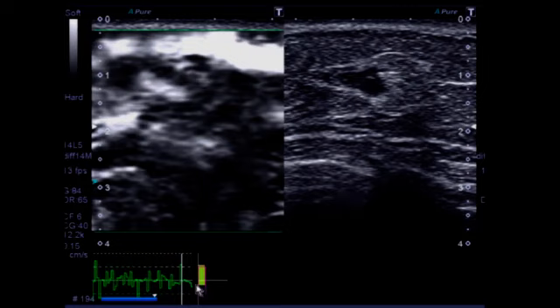And again, here's just an example, and you can see we move things differently, but you can go and find the image where you best have your yellow box filling the purple box to pick the appropriate slice to do your measurements.